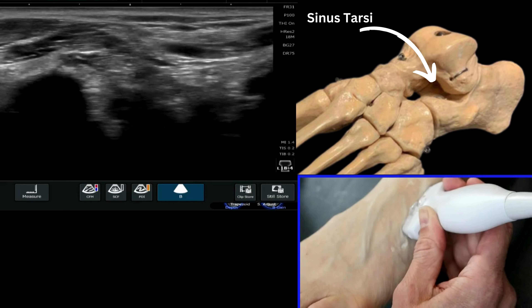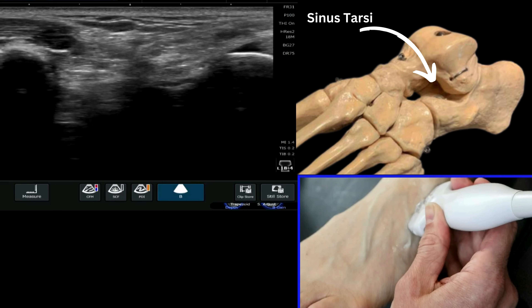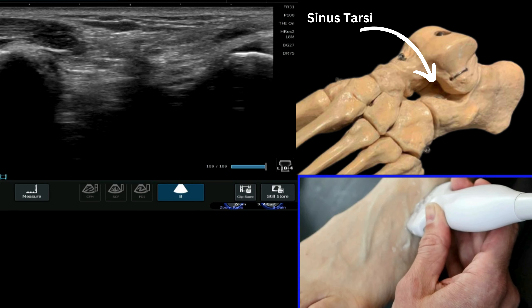Then you will come across that void between the two landmarks, and as you can see with my cursor again here, this is then your sinus tarsi.